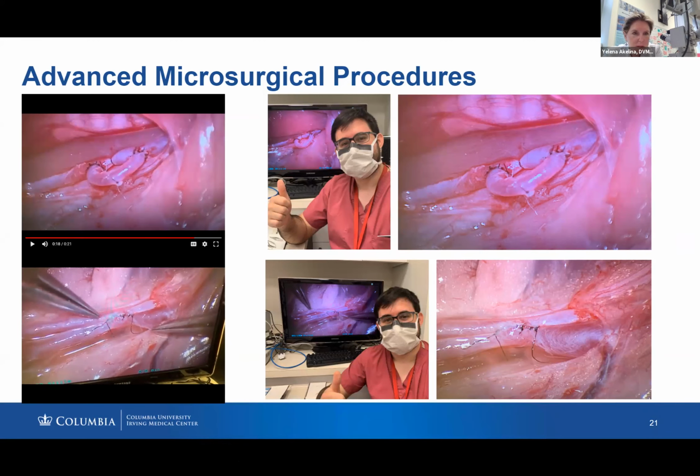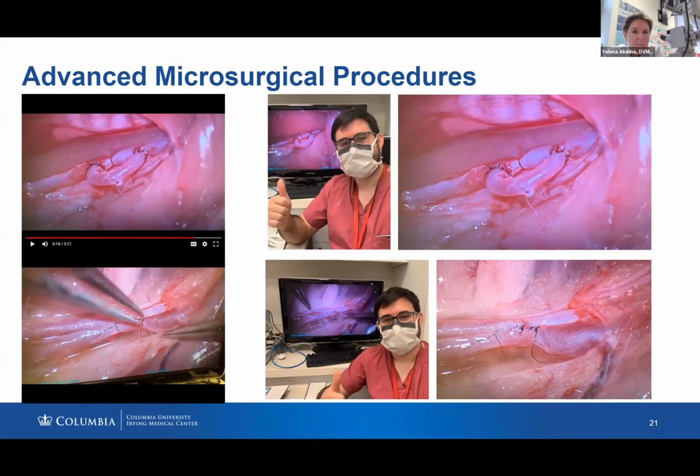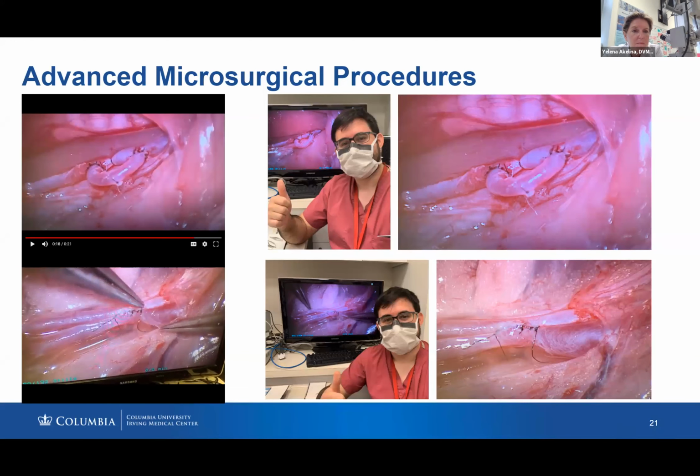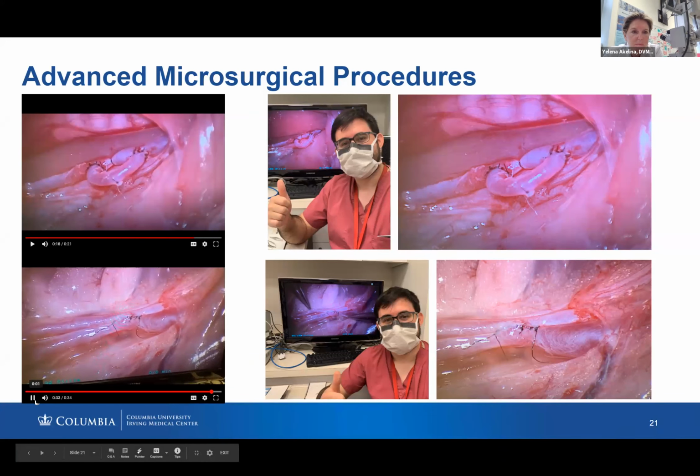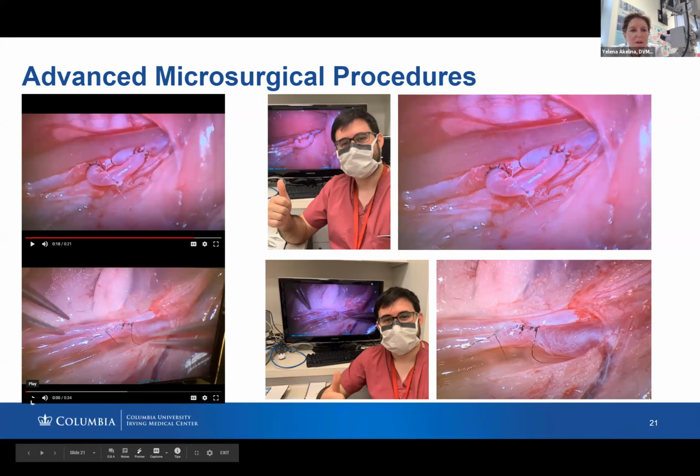So you're using this in neurosurgery for what? Side-to-side anastomosis, yeah, we commonly use it in different kinds of complex cerebrovascular neurosurgery. So amazing. Good job, Jonathan. So this is what we do.